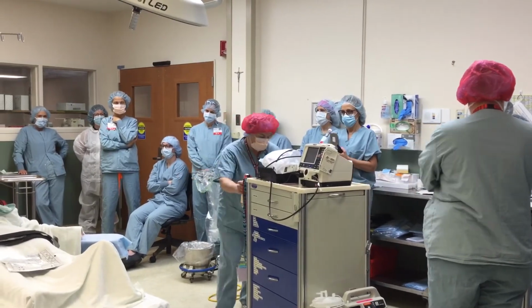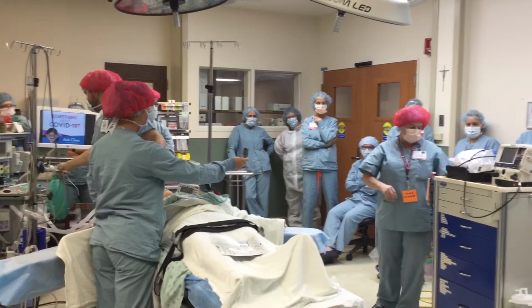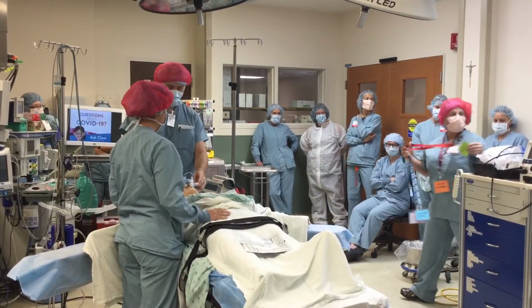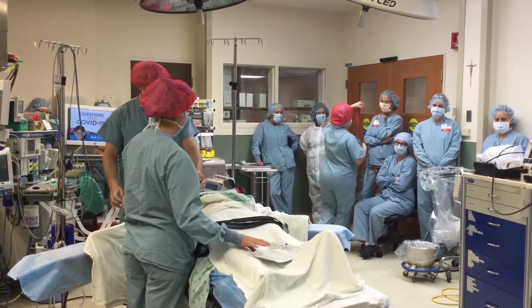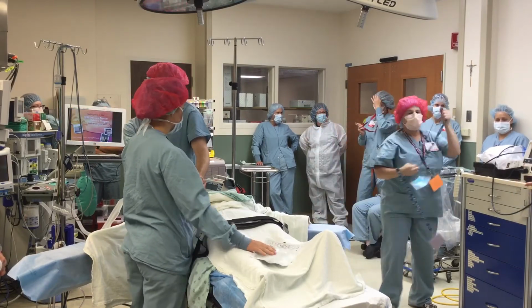Okay, good. So I'm coming in with the crash cart, and I brought some people with me. Hey, what's going on? What do we have here? We have a patient that deteriorated suddenly. We have a shockable rhythm. We need to have pads on, and we need to administer 200 joules, please.